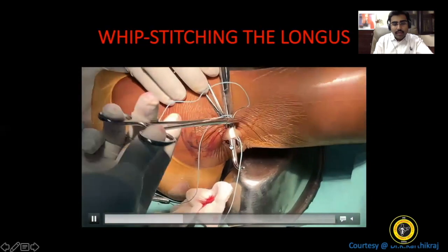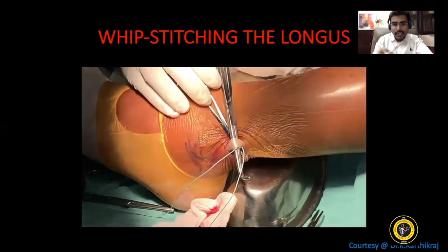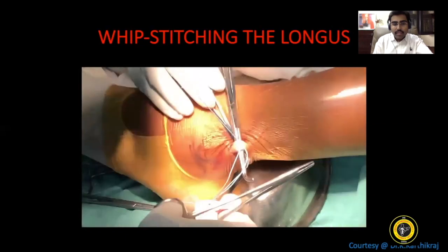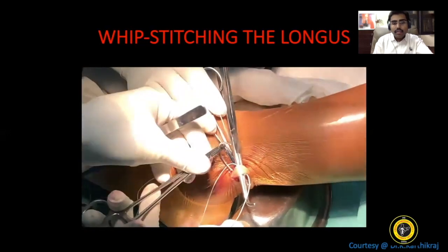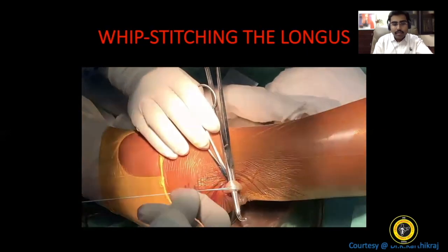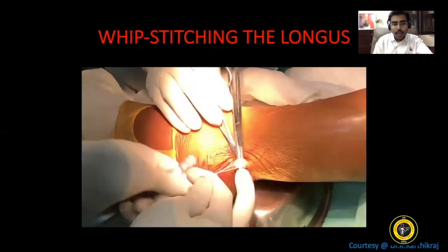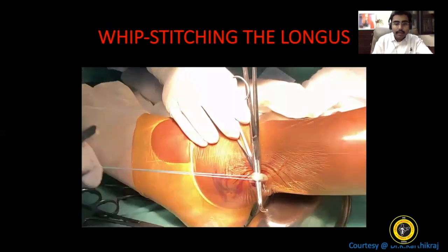Now, I've started to take some whip stitches over the distalmost part of the longus, just above the retromalleolar tunnel. Now, these whip stitches would help us get a good grip, especially while using your tendon stripper for harvesting. I use the Chinese finger stitch mechanism going retro, a couple or maximum 3 stitches should be fine. So getting both the threads in alignment is important to get a uniform pull. Yes, this is the uniform pull you need to get, otherwise it might result in shearing of the tendon.